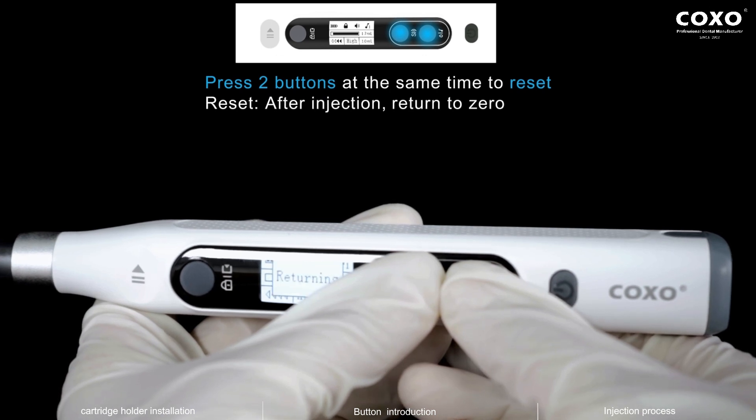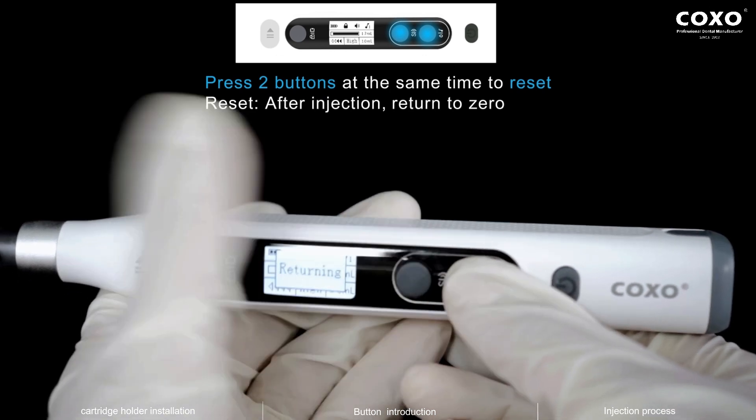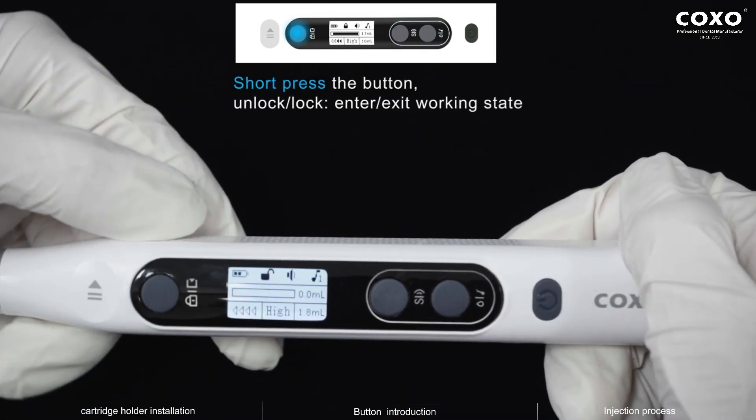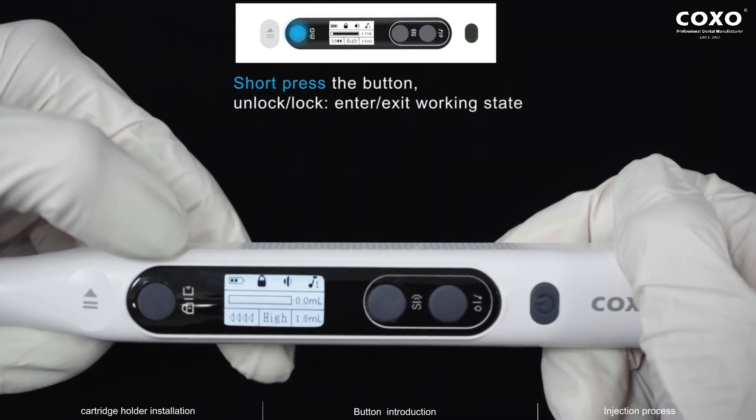Press two buttons at the same time to reset. Reset after injection returns to zero. Short press the button to unlock or lock, and enter or exit working state.